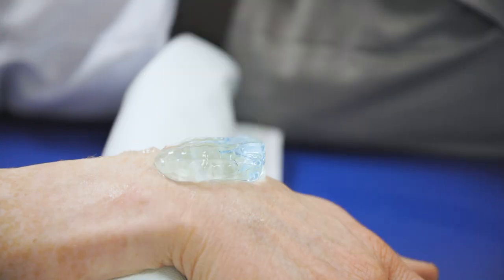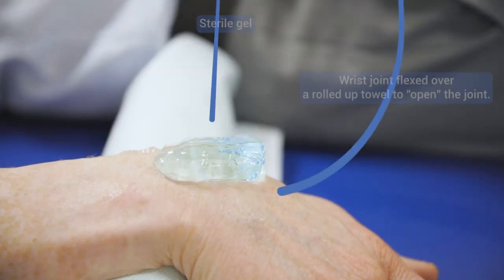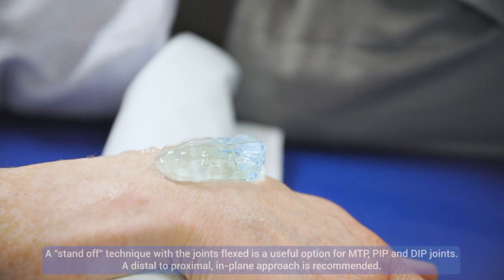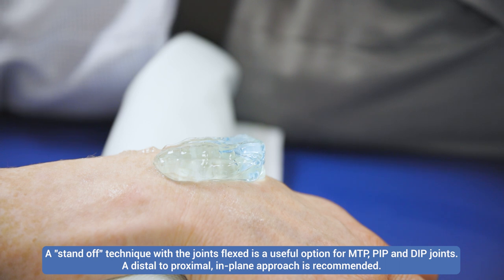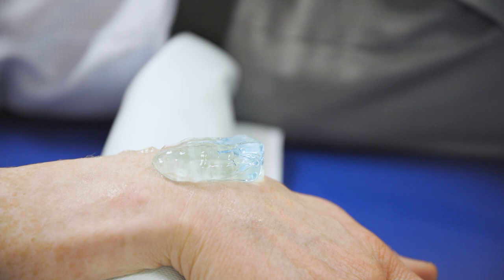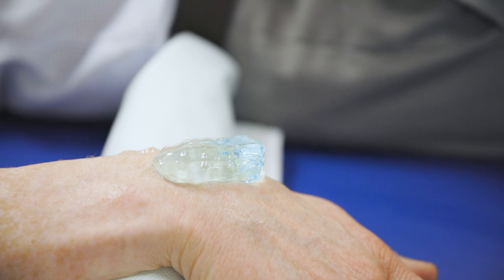This is called a standoff technique. We're going to show it on the wrist because it works well here, but it also works very well for lots of small joints in the hand and in the foot. It's particularly useful where you've got quite clear bony contours, and what the gel does is it fills in those contours to allow good contact between the probe and the skin to ensure that you get a good image.